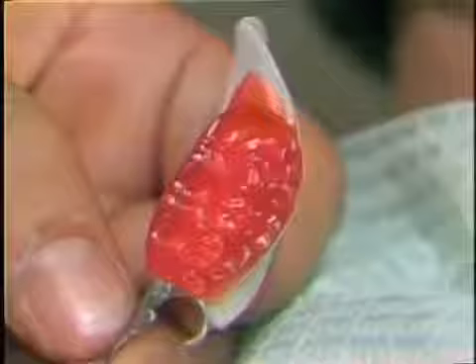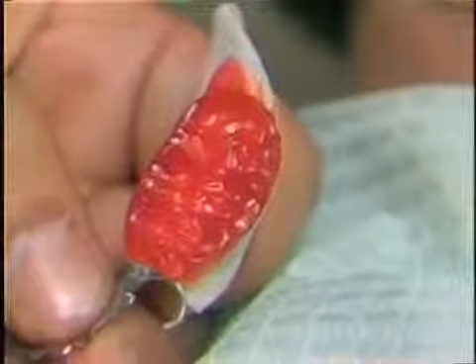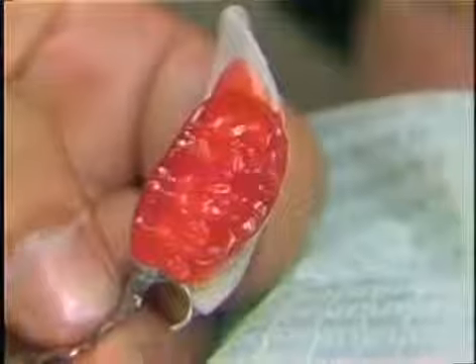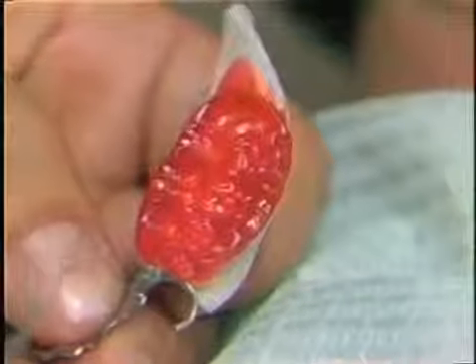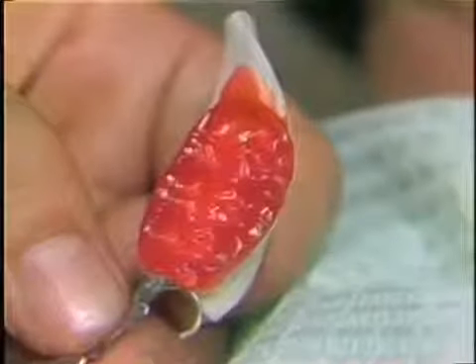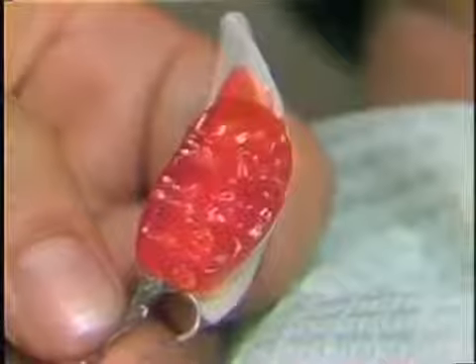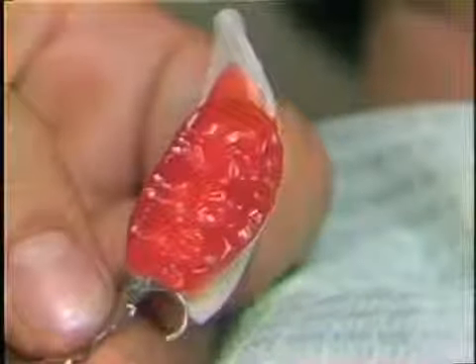And if you do not use it correctly, we know that balanced occlusion is not what we want for the removable partial denture. So in making the template and setting the teeth, this will have to be compensated for, and we will take out or not put in any balancing contacts in the finished occlusion.